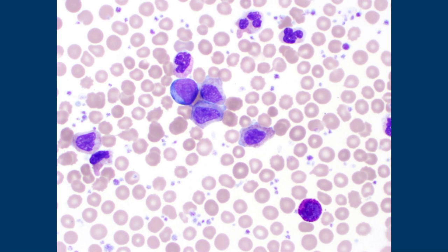CML sort of looks like the bone marrow has spilled into the peripheral blood, because you have all the stages of maturation. You'll often see a myelocyte bulge — I was saying myelocyte, myelocyte, myelocyte — and then you get a basophilia, and you'll often also get an absolute eosinophilia. CML can present in a lot of different ways.